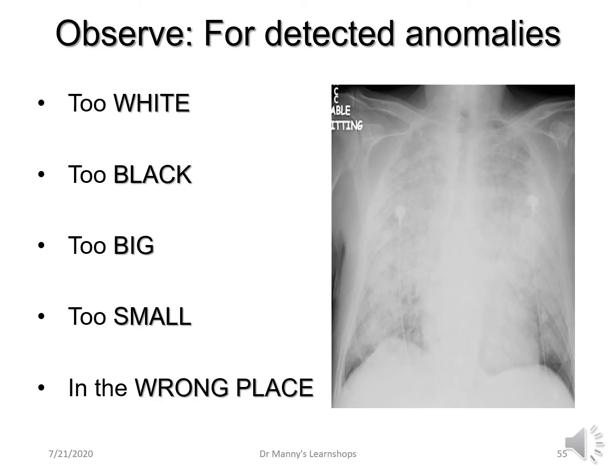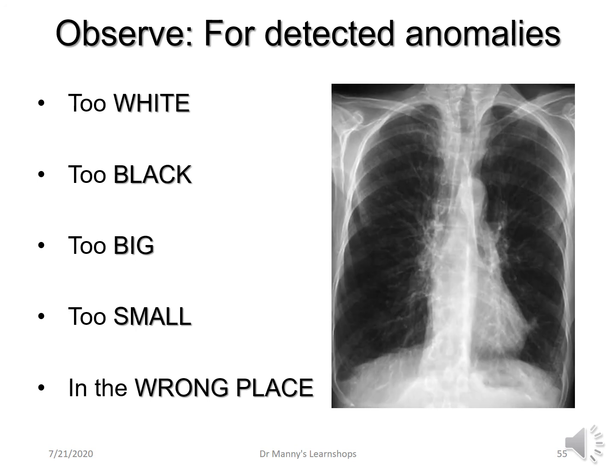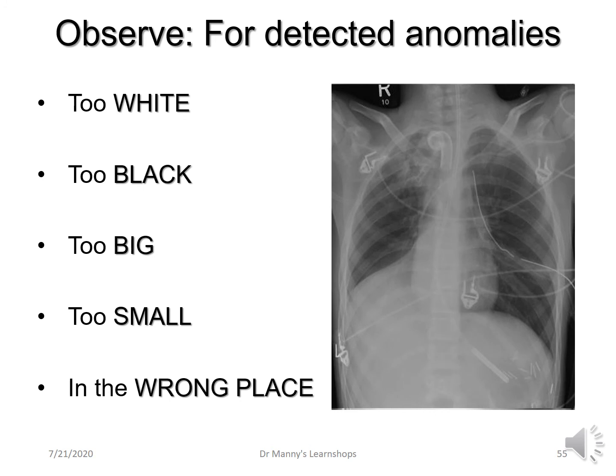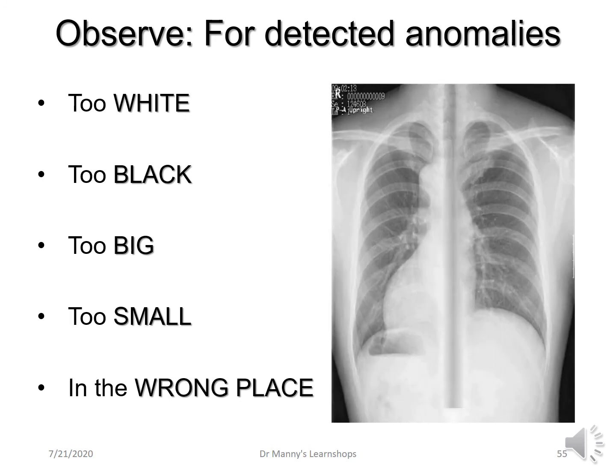Always observe your anomalies in the format of: is it too white? Is it too black? Is it too big? Is it too small? Is it in the wrong place? You may not know what the consequences are. That's the job for the radiologist, not the radiographer, not the nurse, not even some of the physicians.